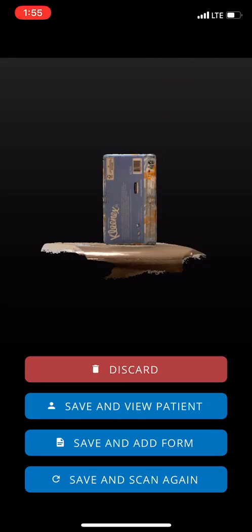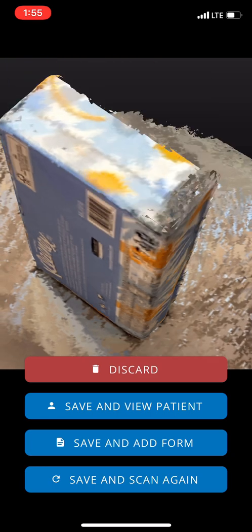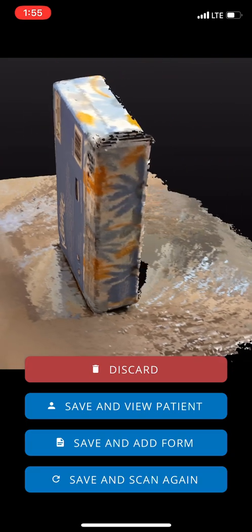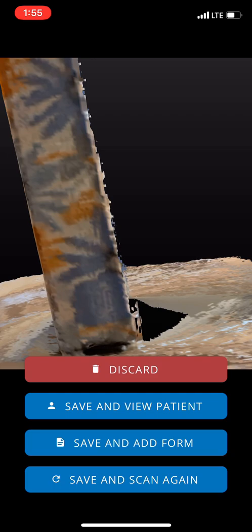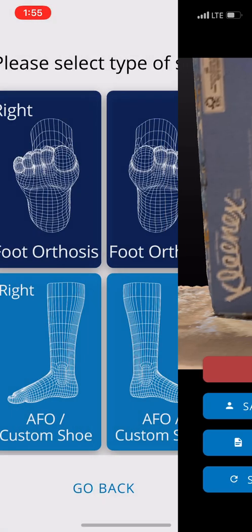Now I can zoom in with my fingers and inspect the contour of the Kleenex box. That looks really nice — I've got a little hole here, but that's not the end of the world. In general, we've got a really nice high quality scan. The coloring's a little off, but the corners and the shape of this box are really accurate. I'm going to go ahead and save and scan again.